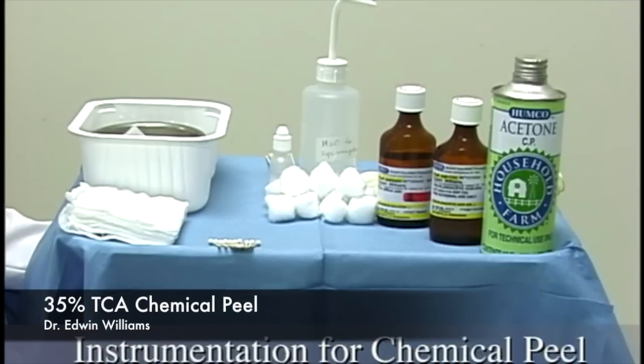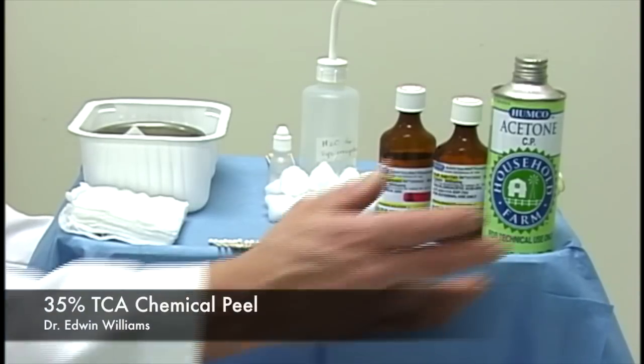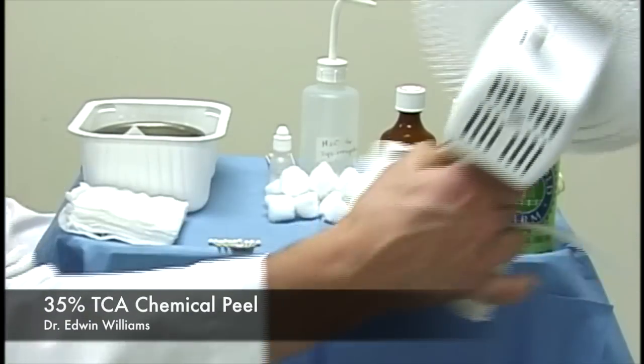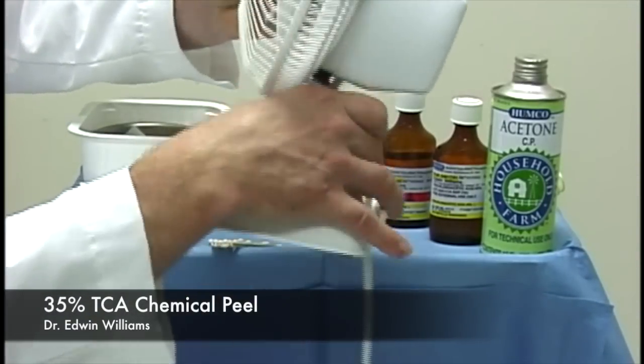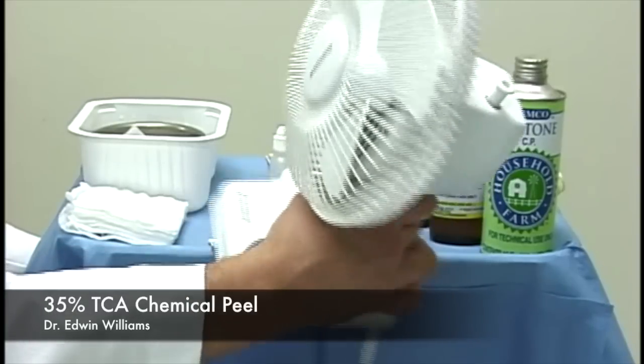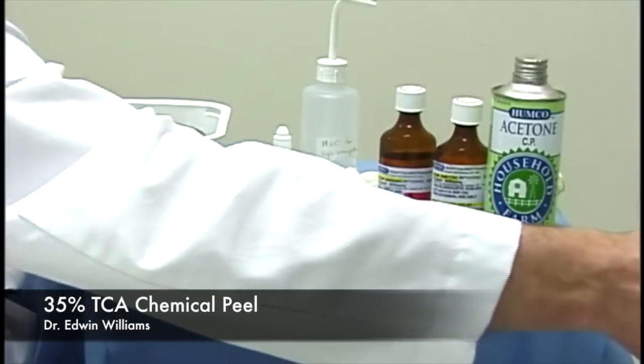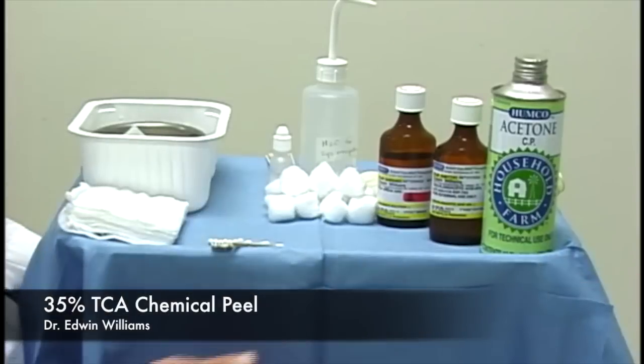The setup for a chemical peel with trichloroacetic acid is fairly simple and straightforward, but it's important to review the components. The first is the fan. Sometimes there are handheld fans that serve well, but we find something a little bigger works much better to blow across the patient's face. It's also important for the patient not to hold the fan, especially when giving them sedation, because they become groggy and the fan ends up in a different direction.